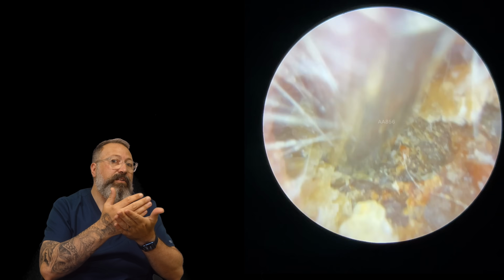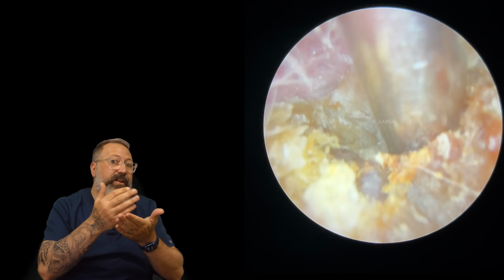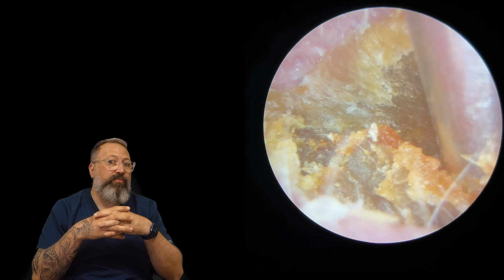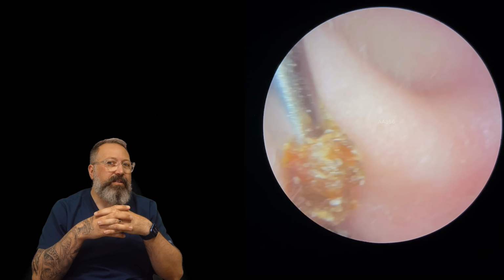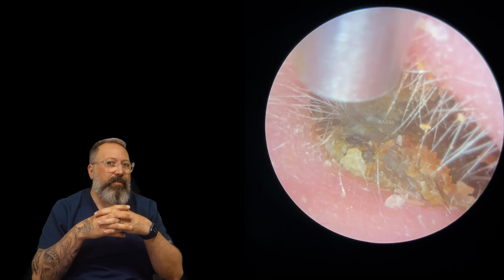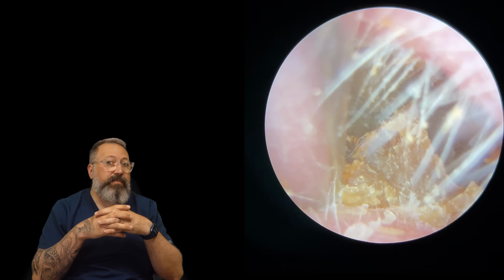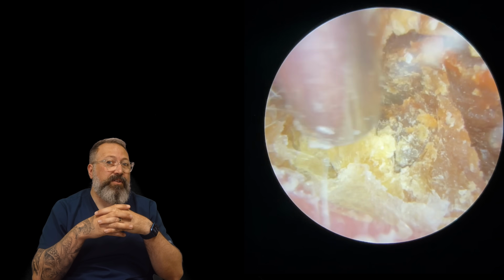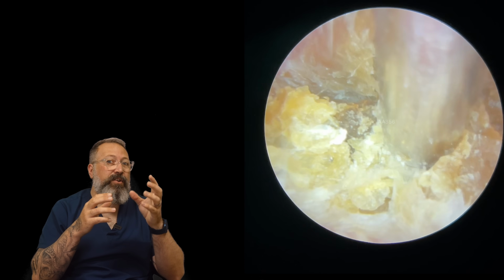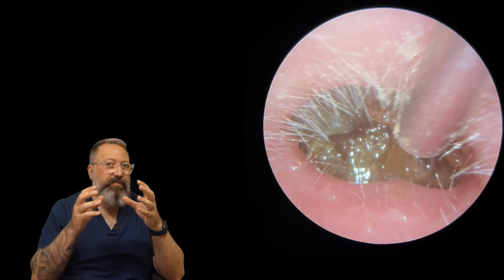As I'm moving it, any looser bits are getting sucked inside the suction tube, but we're also just pressing down on the side as well, just to try and break a gap around that surface. There we are. It's starting to break down a little bit now. We are going to use some olive oil in a second, but I'm just tidying up these edges and getting this away. The wax was so close to the outside part of the ear canal. If I put some olive oil in at that point, it would have been all over the cilia and it would have really been difficult for us to maintain the view.